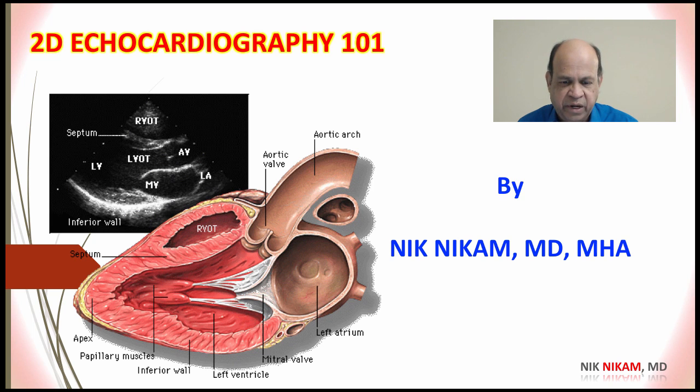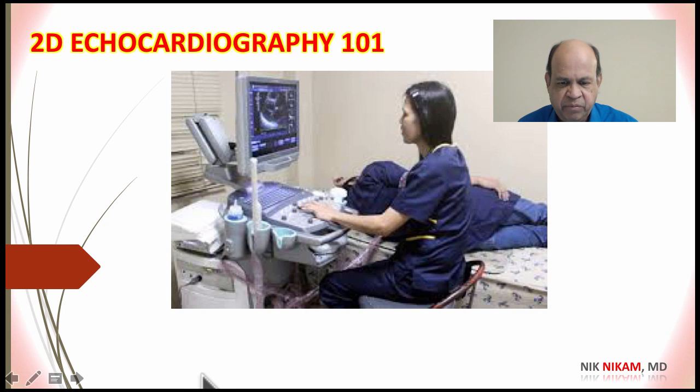So let us begin. Today, echocardiogram is performed in an office setting or in a hospital using a machine similar to this, and I have been performing echocardiograms for more than 30 years using an echo machine in my office.